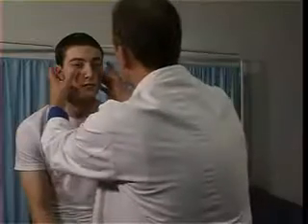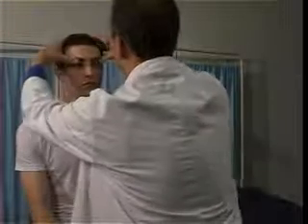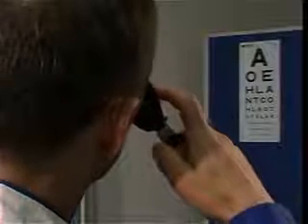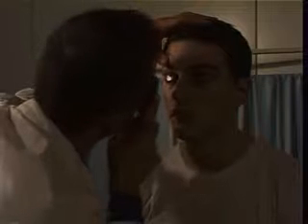You may wish to examine first the external features of the eye, including the eyelashes, the lid margins, the sclera, and conjunctiva. Begin at arm's length using the widest beam. Set the diopter to 0 or at the setting you established when it was calibrated for your vision. Throughout the examination, hold the handle slightly to one side, away from the patient's face, and keep your index finger on the wheel of the lens, so that lenses can be changed easily.